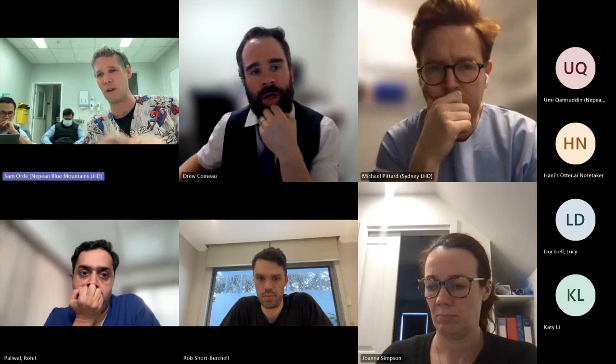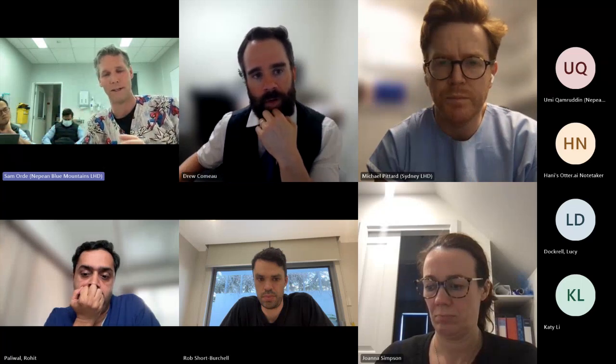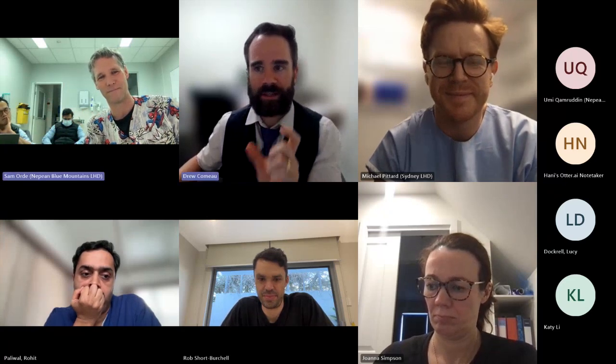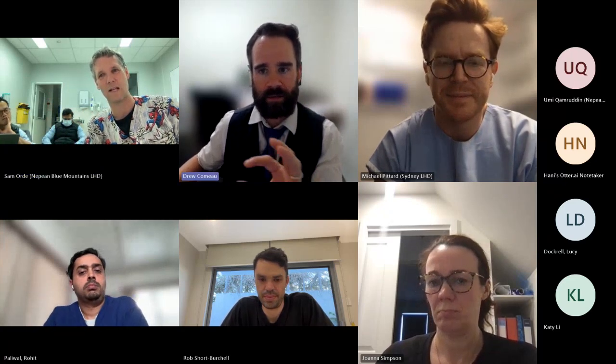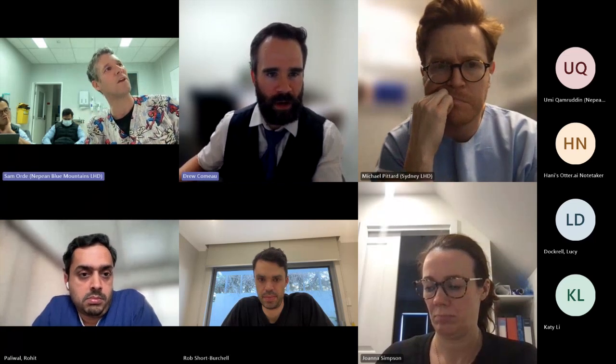Because we'll have a marking grid that won't have anything about all the different views. It would all be about the mitral valve, and hopefully normally it's Richard Strickland that picks me up on that stuff and doesn't let me get away with writing dodgy questions. But if you say views, that should be views, and it's modes when you say what other mode? What other? Or how else?